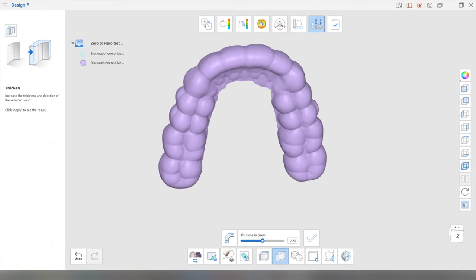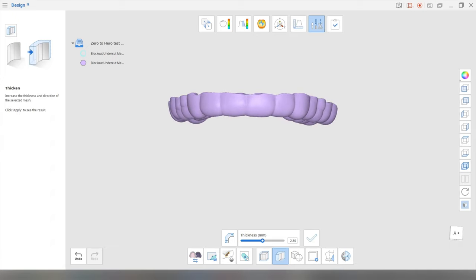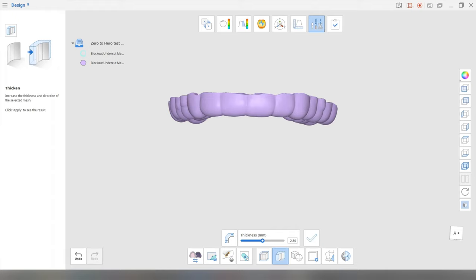Now we've got to deal with the bite. So the next step is to actually remove all the interferences with your lower arch. So, hopefully you've taken your scan with an open bite. Otherwise you can do it in the software using this transformation tool. But in my opinion, creating or opening a bite in software is very unpredictable. So it's always preferable that you take the bite during your scan. Okay.